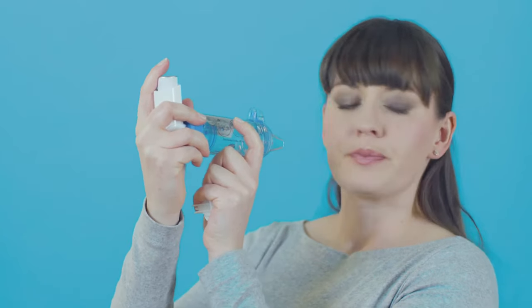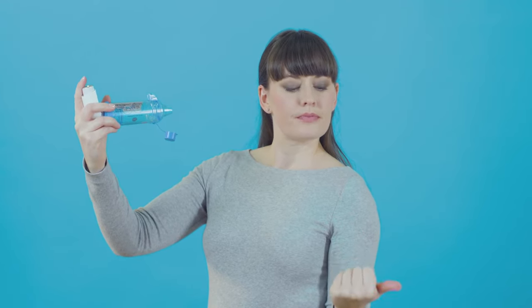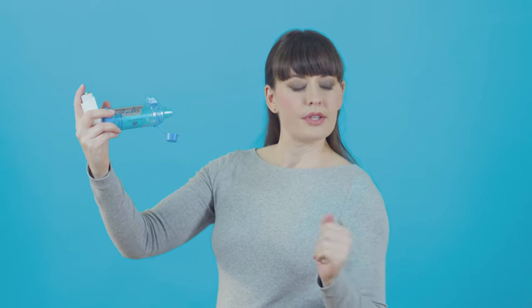Take the mouthpiece of the spacer out of your mouth and with your lips closed, hold your breath up to 10 seconds or for as long as you comfortably can. Then breathe out gently away from the spacer.